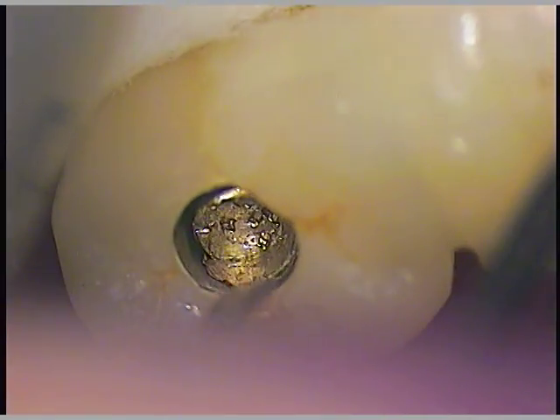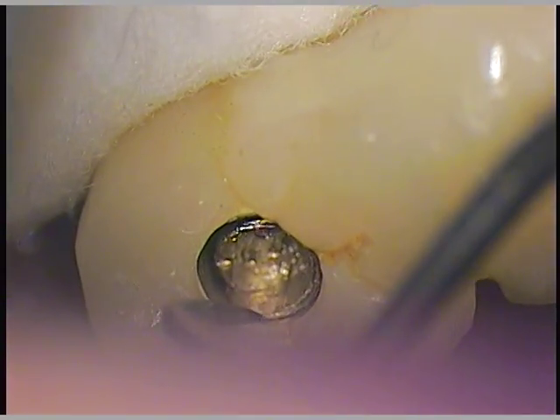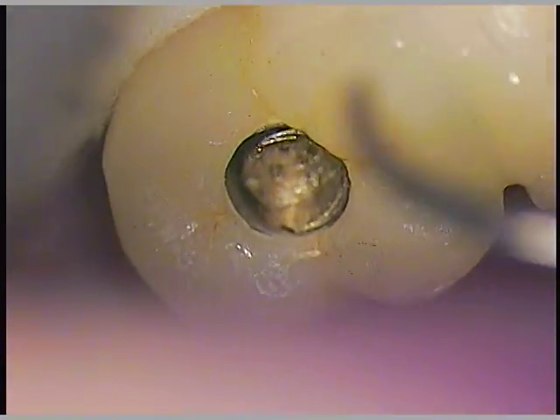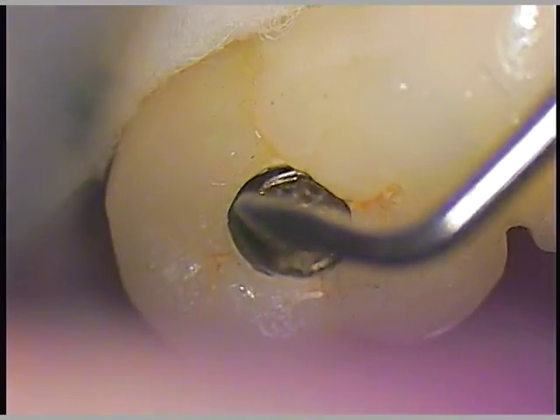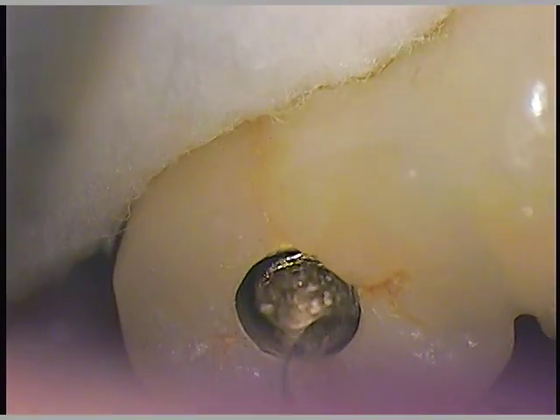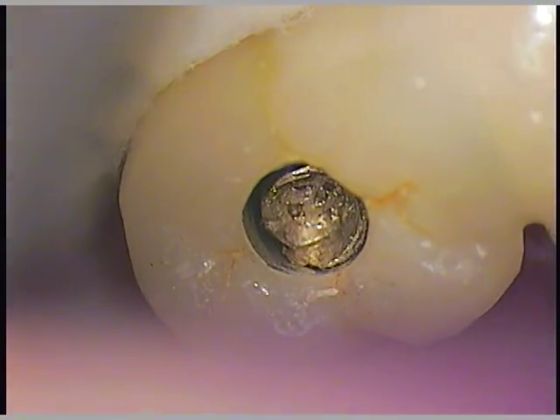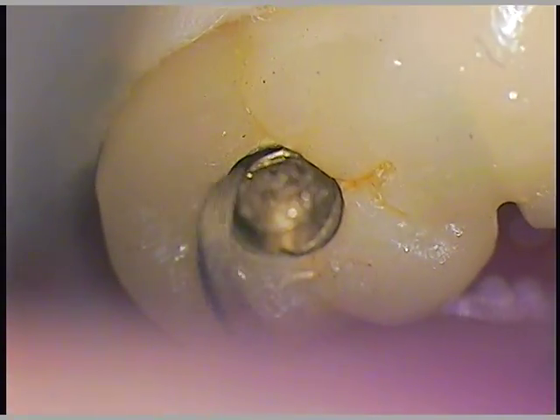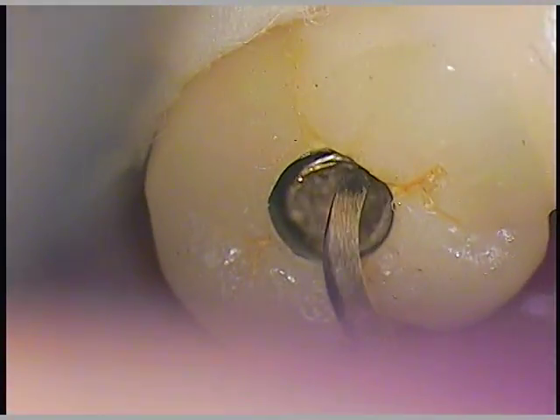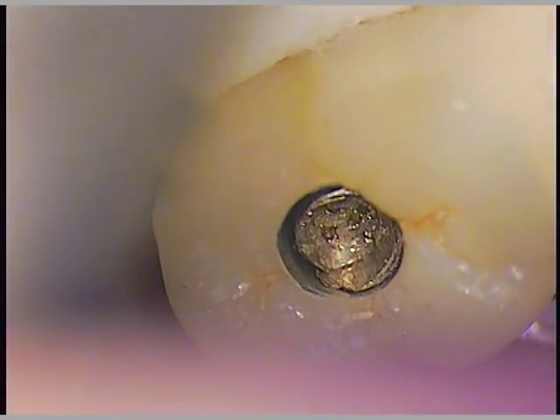Now the head is coming up, and there's something preventing the head from coming up and out. That could be the angle of the screw entry hole itself — the access hole — that could be preventing it. Or there may be material down underneath that's caught. So we're going to rinse it again.